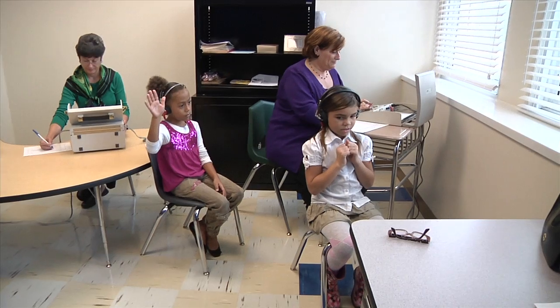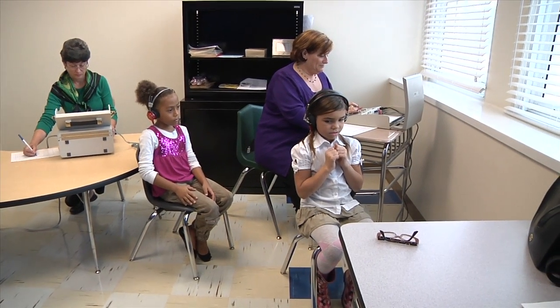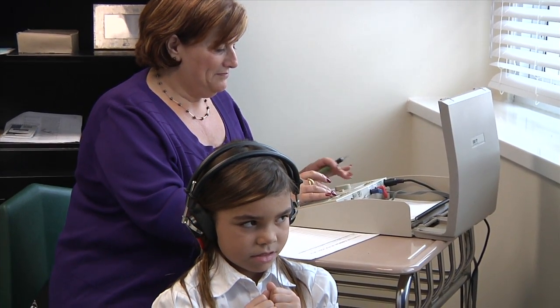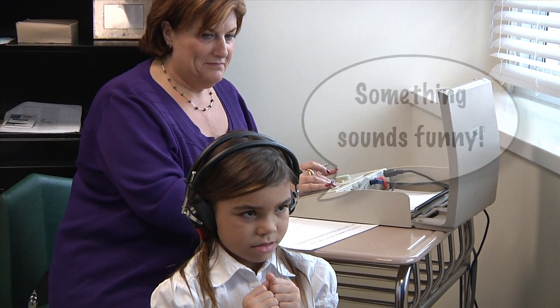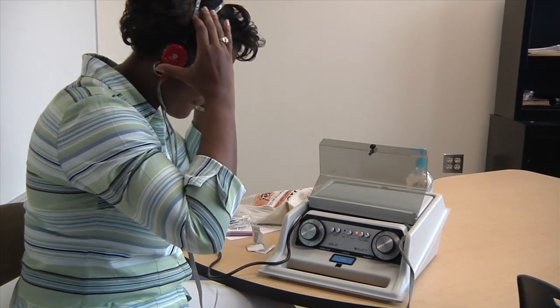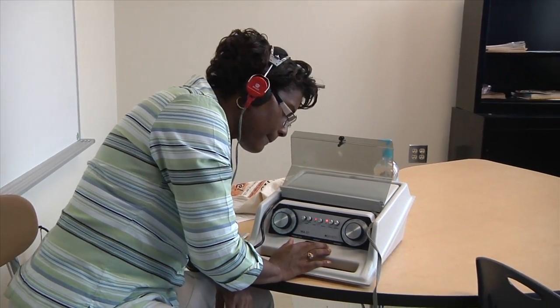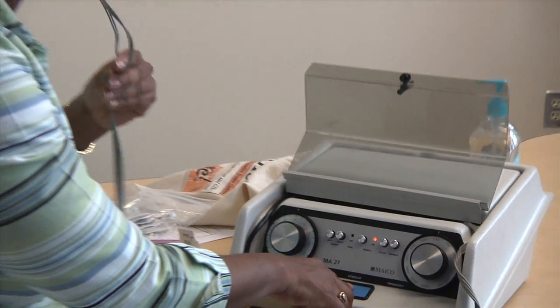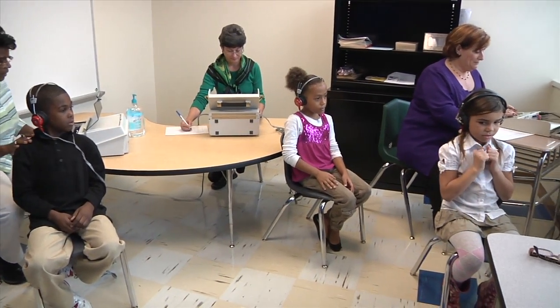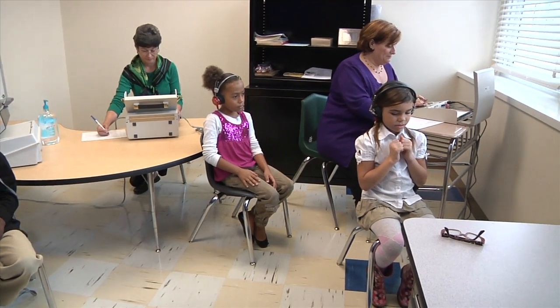If the lights blink on and off, check the power cord. It may have come away from the wall or the audiometer, or the connection may be loose. If a child reports unusual sounds such as cracking when they move, do a repeat listening check and move the cords while playing a continuous tone to see if the sound reoccurs. If the equipment is faulty and you don't have a backup, discard the screening results for the children affected by the malfunction and reschedule the screening.